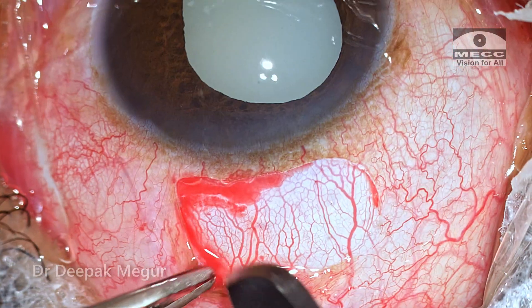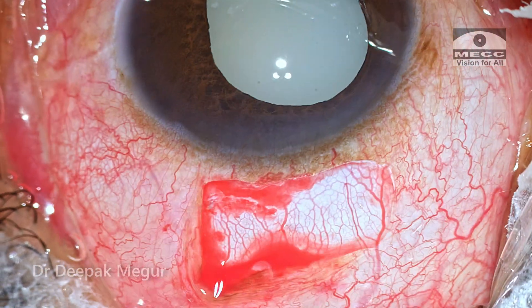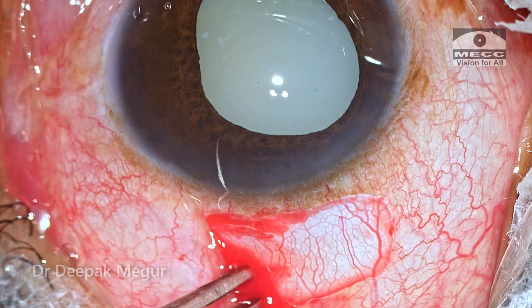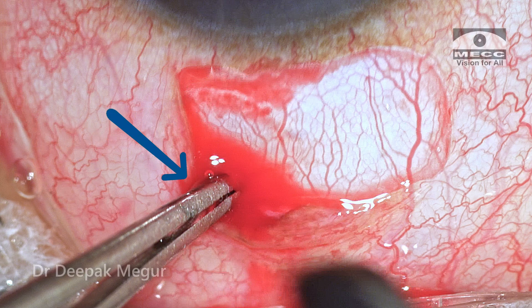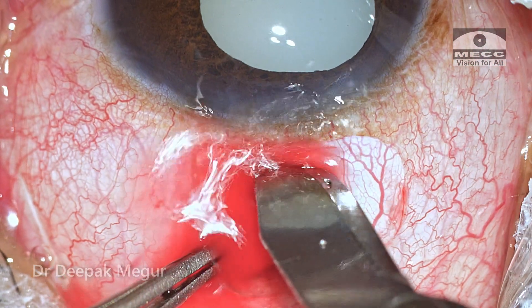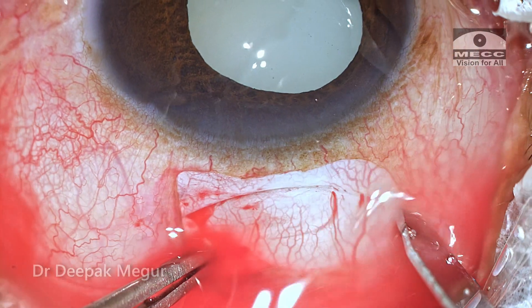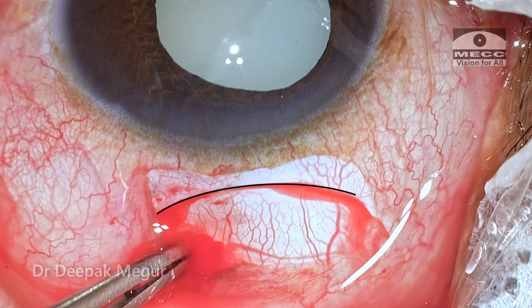Once the conjunctival flap is raised, I make a small scleral groove much more posterior than the intended area of incision. This acts as a fixation groove. I stabilize the globe using a Hoskins forceps and then make a 6 millimeter frown-shaped scleral incision. My assistant is irrigating with BSS to aid visualization as I'm not using any cautery.